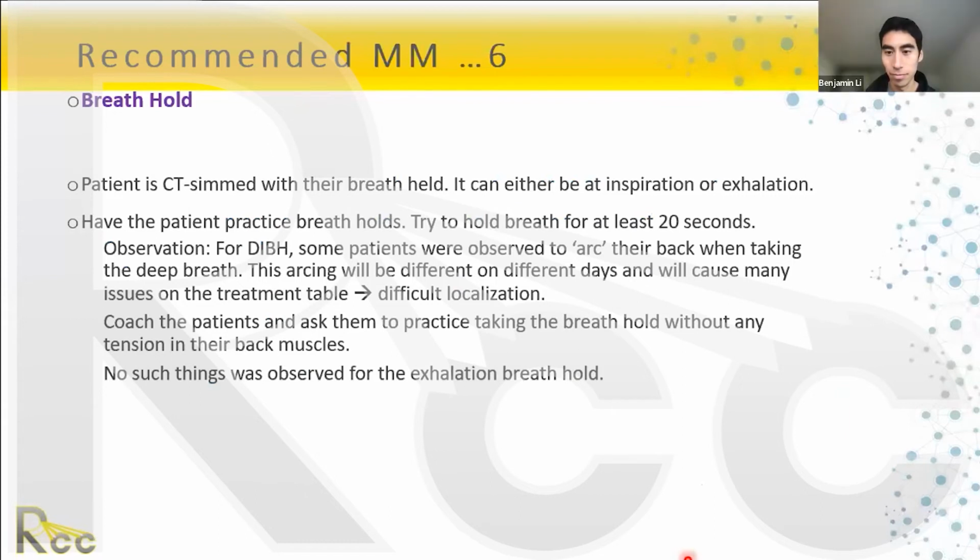Even for breath hold, we're going to see it's not easy to do. Breath hold, whether it's maximum inspiration or full exhalation, whether it's deep inspiration or deep exhalation, means you want to ask the patient to hold their breath. Let's do this test. Exhale and hold your breath. Let's see how long you can do that. While you're doing that, notice if your back is arched.